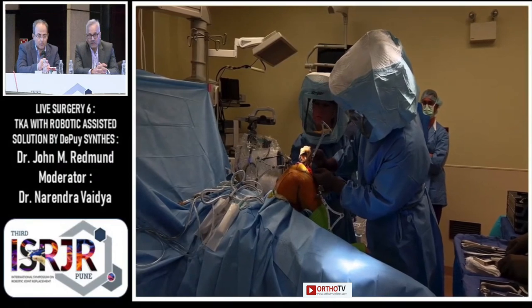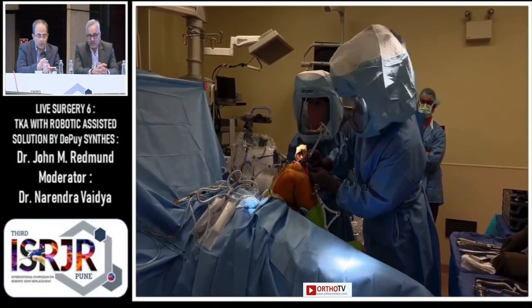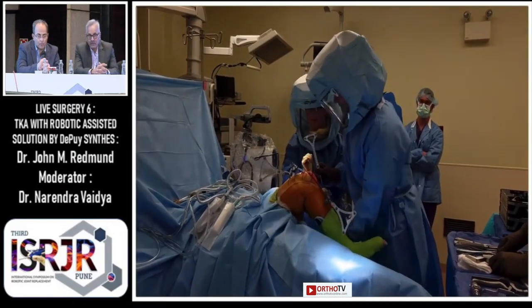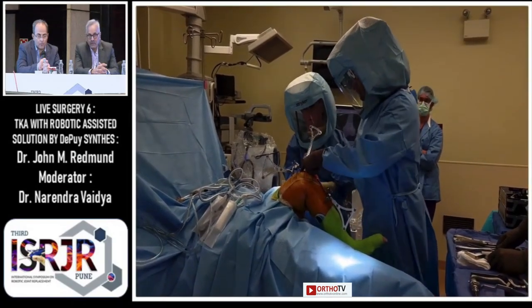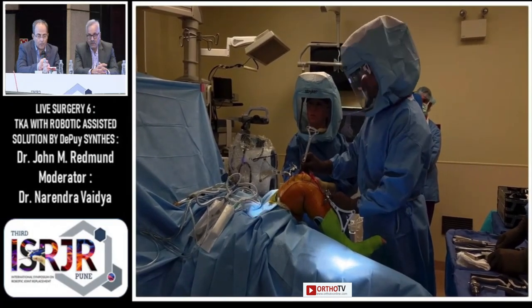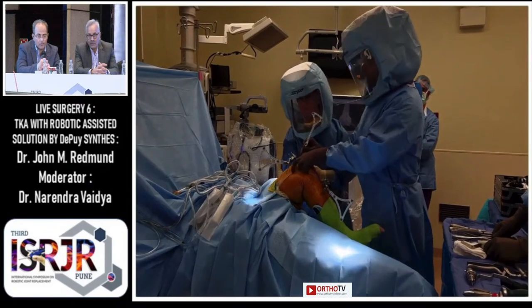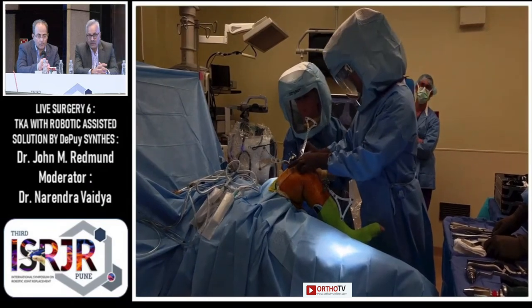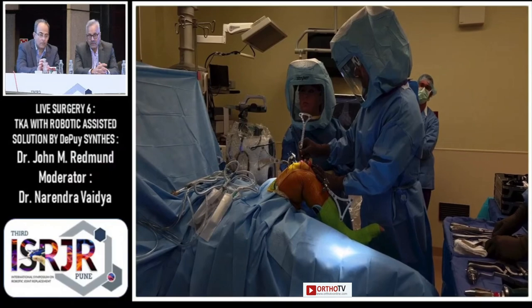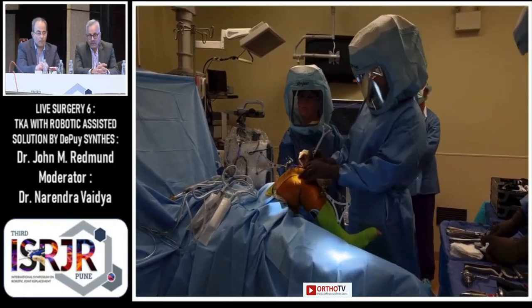Here I'm painting the femur — you paint the distal condyles and the posterior condyles. The computer takes 200 spots along the condyles to define the most distal and most posterior aspects. Then you run the pointer along the anterior cortex of the femur so that it knows where the saw blade will exit for the anterior aspect of the femoral component.